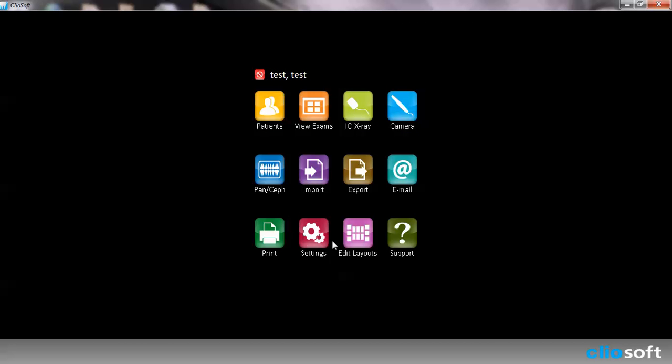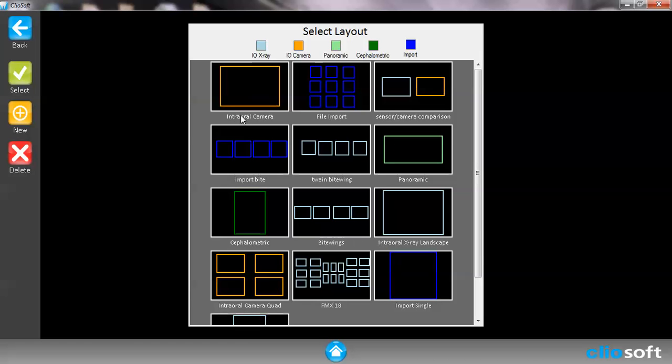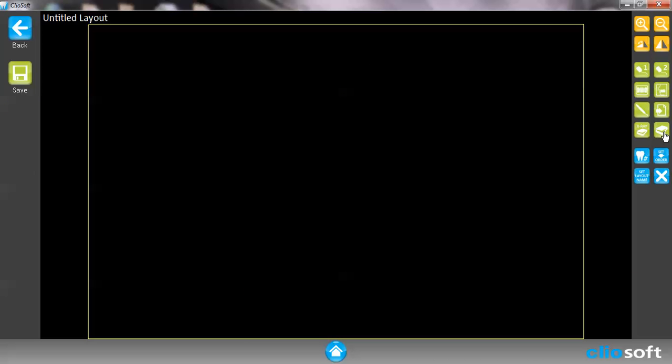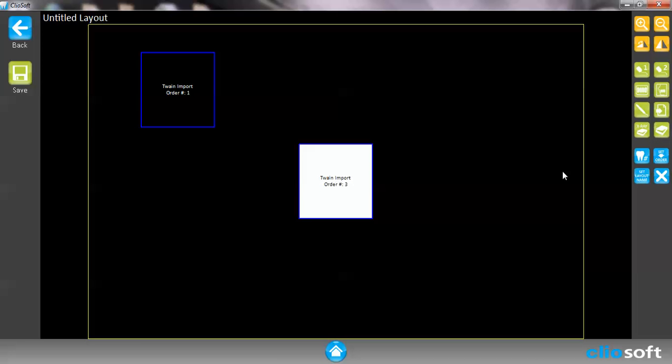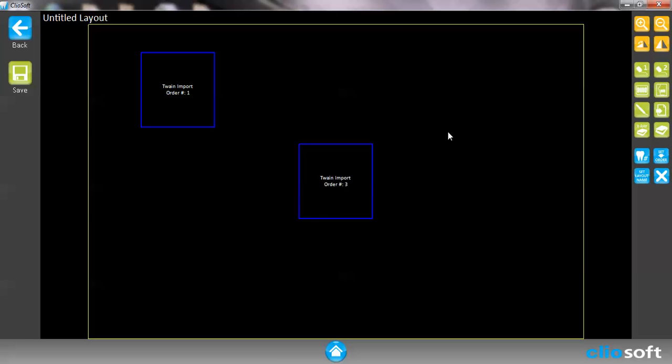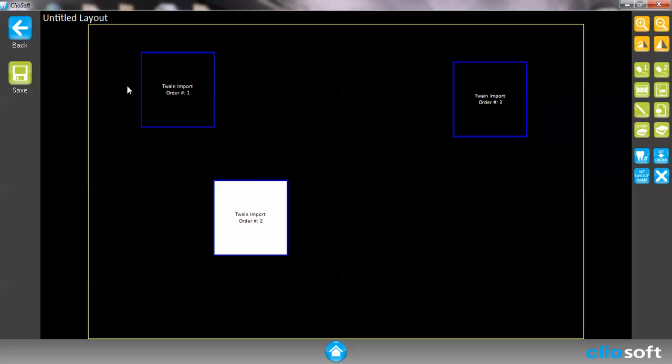Let's go ahead and get back to our edit layout and new layout. We can go ahead and put scanner. If you wanted to use a digital scanner to add images into your ClioSoft, you would have to use this right here. It's called an import twain placeholder. What that is is a twain scanner. You would create any kind of layout you have wanted with this and then you can save it. And now you can actually use your digital scanner to put images into your ClioSoft.